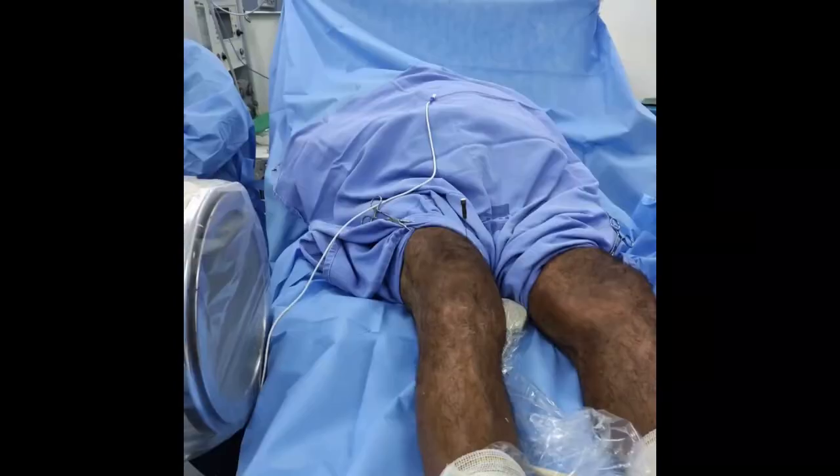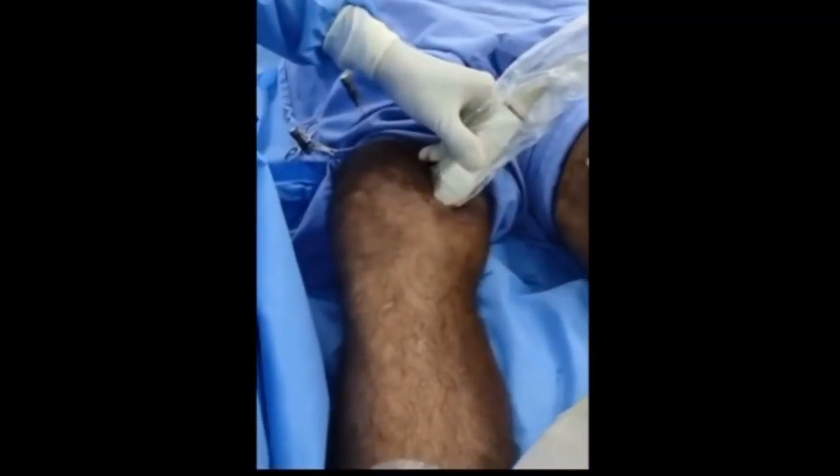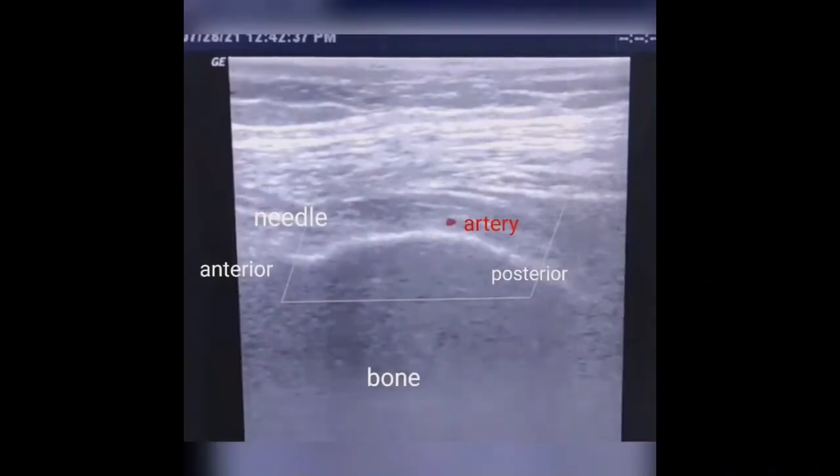Rhizotomy of the supramedial genicular nerve follows the same parameters as the lateral, except that now the needle enters close to the periosteum of the medial femoral aspect.